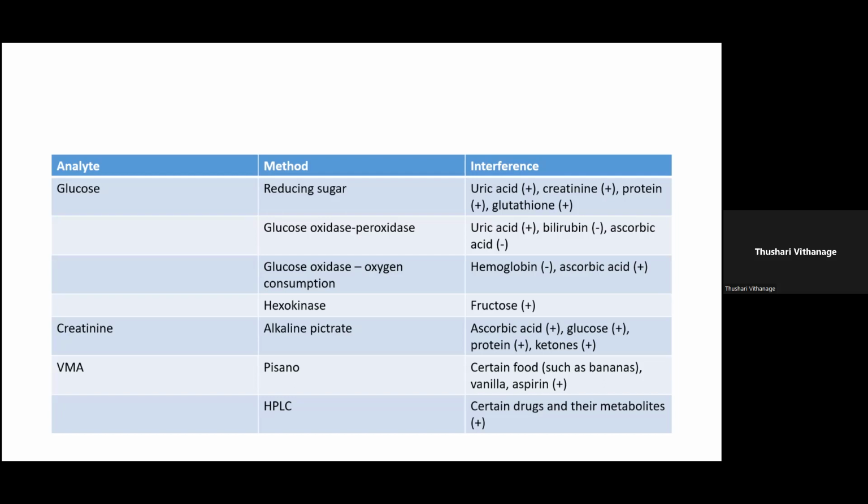As with the previous one, in the creatinine assay, the Jaffe reaction, ascorbic acid, glucose, protein and ketones cause positive interference. If we measure VMA also by two different methods, which I have mentioned here, it also causes positive interferences.